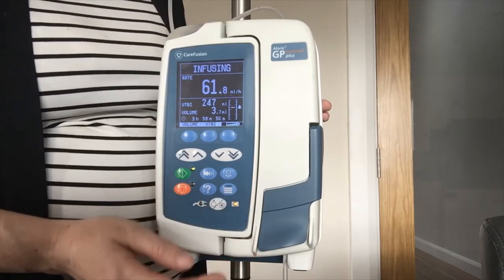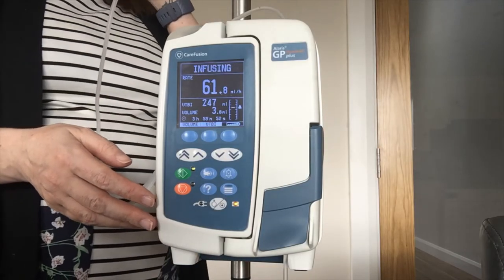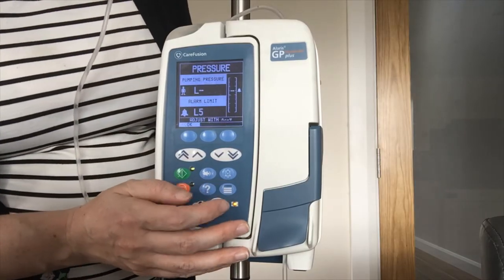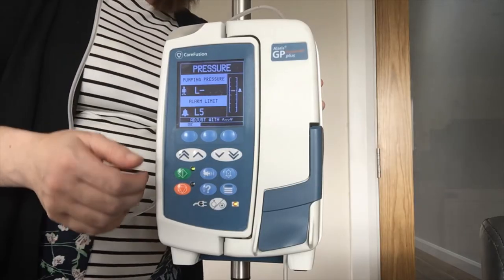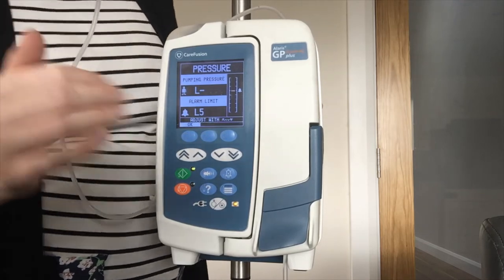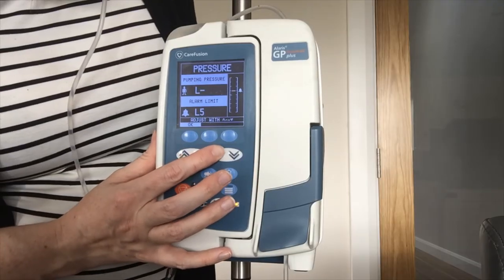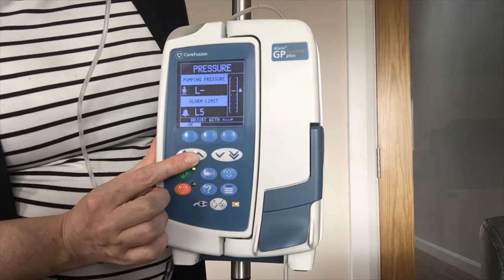The last button pertains to your pressure levels. These tend to be defaulted to level five. For occlusion sensitivity, you can press the pressure level button and adjust using your arrows. Bringing your alarm level higher will make your pump less sensitive to occlusions in the line; bringing it lower will make it more sensitive.